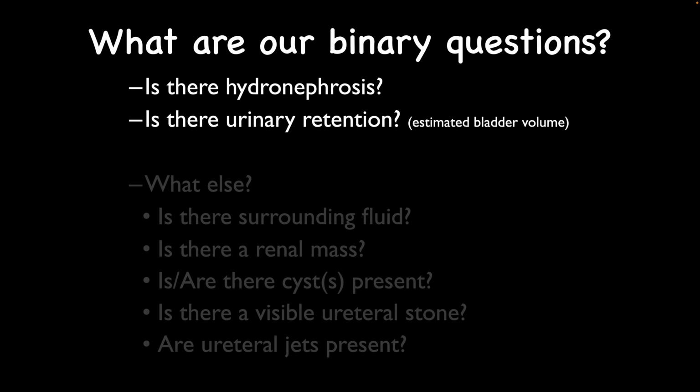These others, what else could be going on that you see below? Those are things we should, over time, be able to recognize, but they are not the focus, especially when we look at point-of-care ultrasound in acute renal failure. Instead, we should be able to look for those signs of obstruction. Hopefully we recognize those other things, but this is what we're wanting to do.